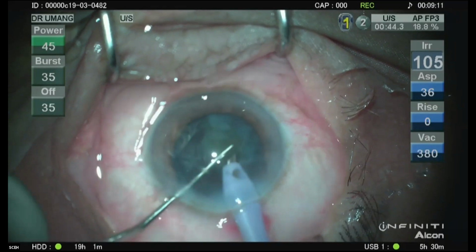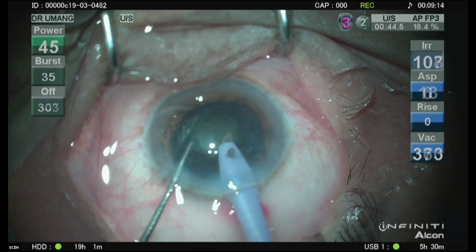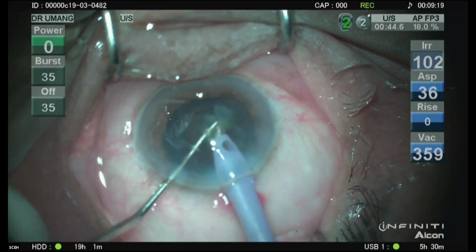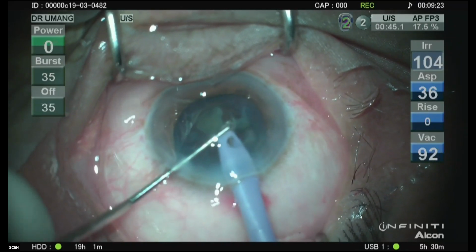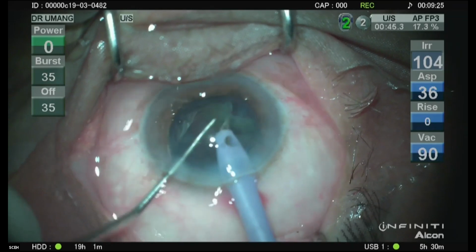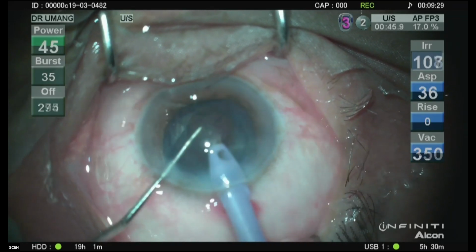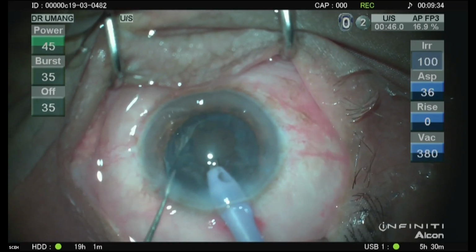So with my foot pedal, I'm controlling it to be slower. I want things to go slowly in. I don't want a lot of vacuum. Okay, so I have all the nucleus out.